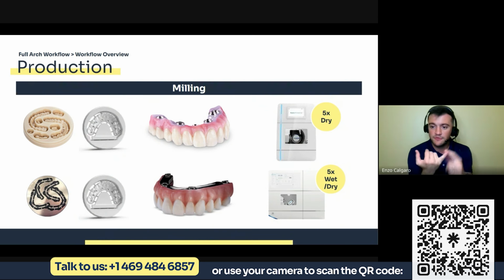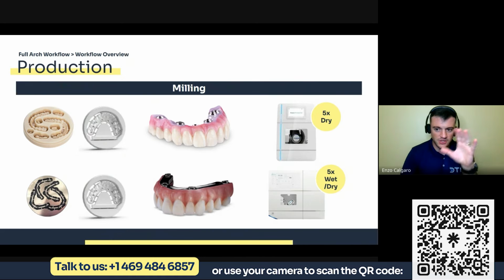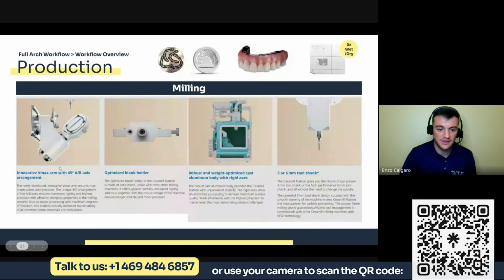If you want to do a full zirconia, you can use a 5-axis dry only mill like the Motion 3 Air. We're going to talk a little bit more about them. That's the one that Brian has on his background over there. And if you want to do zirconia with a TI bar, you need a wet and dry mill, but not any wet and dry mill. It's not every hybrid mill that is able to properly handle titanium milling.